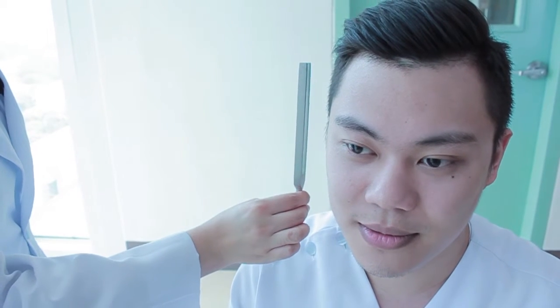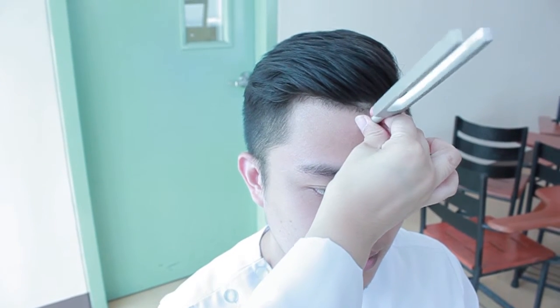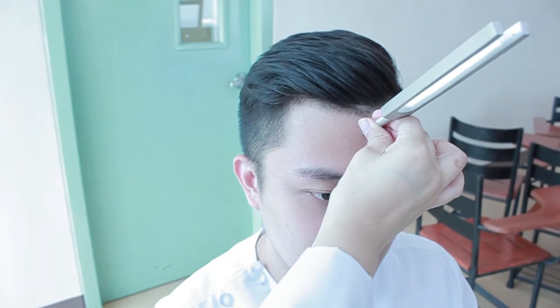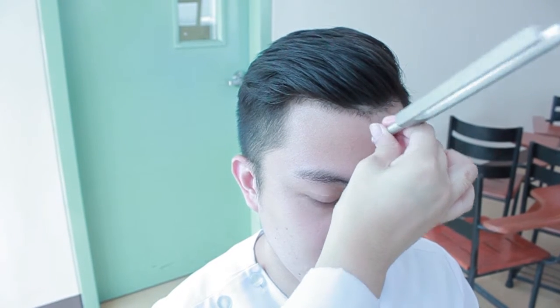Classically, the tuning fork is louder in the better hearing ear in a neurosensory hearing loss, and in the worse ear if there is a conductive hearing loss on that side. The other test is known as the Rinne test, in which the tuning fork is placed on the top of the mastoid tip and then in front of the ear canal.